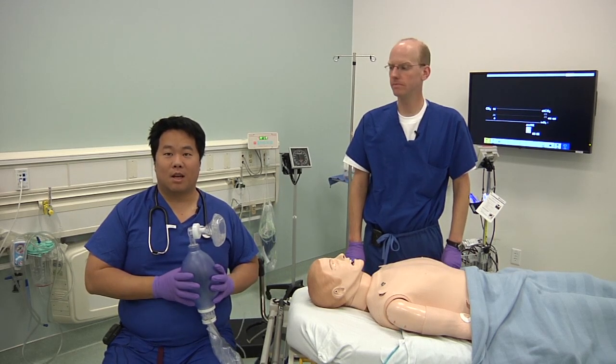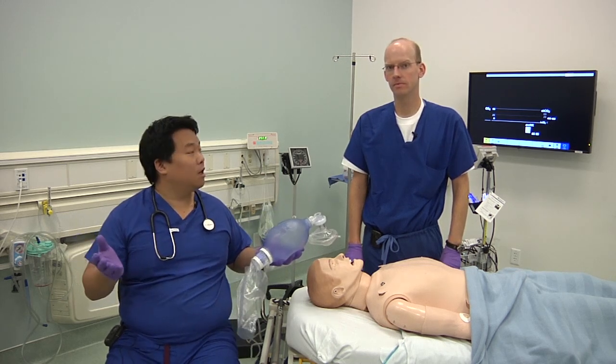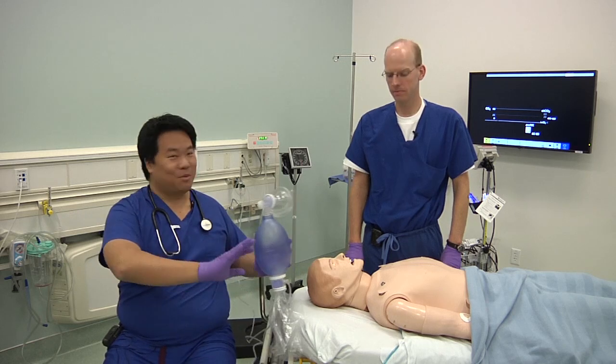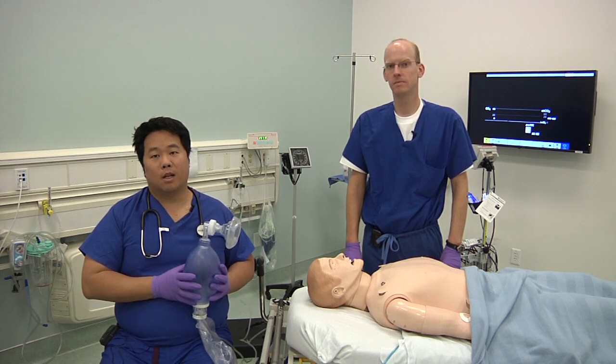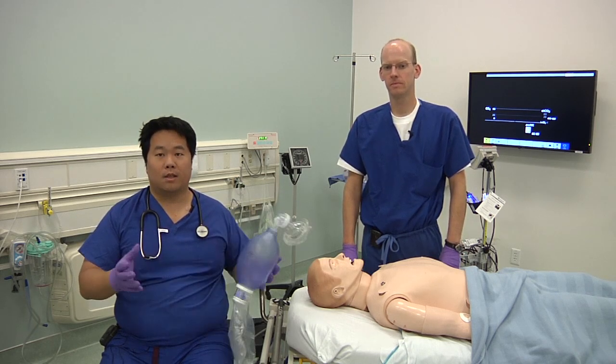We're just practicing airway management techniques during a crisis. So one of the things that we thought we'd show you first is the correct way to manage an airway when you have time and it's not a crisis. This is not the way to do it. And then after that, we can compare and contrast how airway management differs when you're in a crisis and you're doing chest compressions.